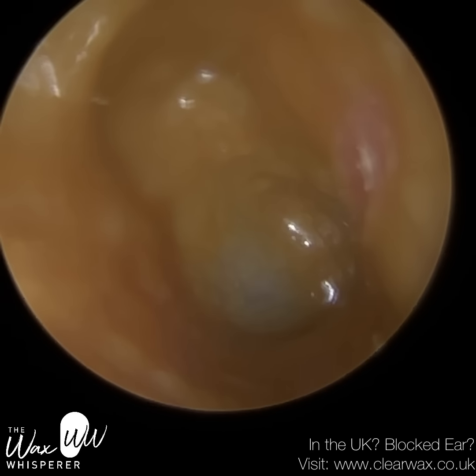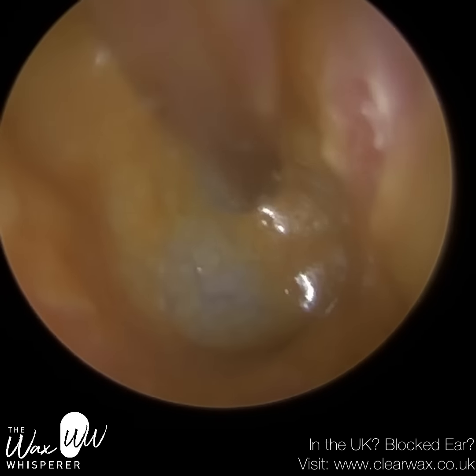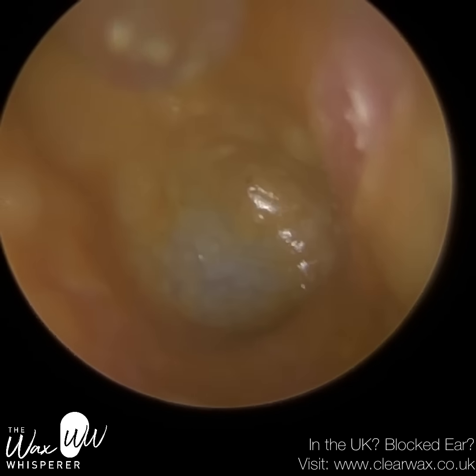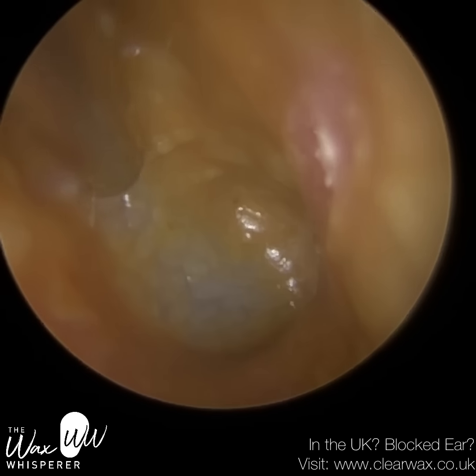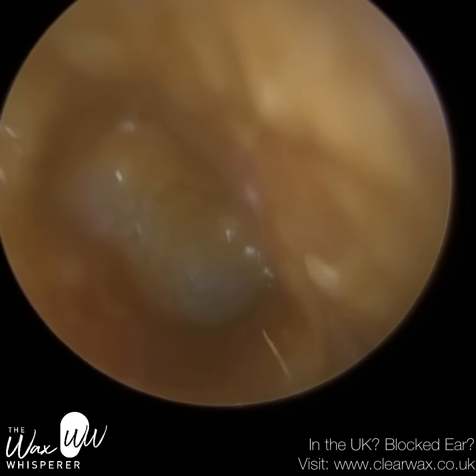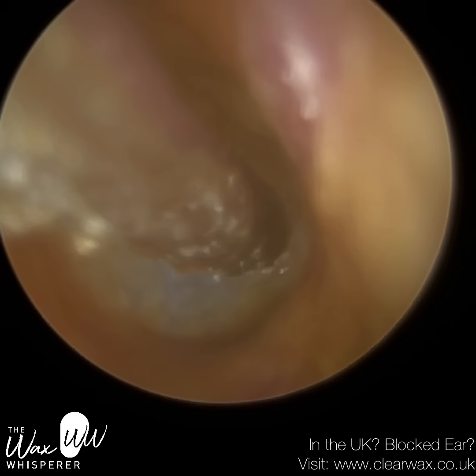And I don't know whether you've just seen that, but I have already caused a bit of very mild trauma to the patient's ear canal. Just to the right, you can see I grazed the ear canal slightly. That part of the ear canal is the anterior canal wall. And the ear canal in this region narrows inwards and widens back out again. That narrowing is called an isthmus. And because of the narrowing and widening, it creates a little alcove to the right-hand side.